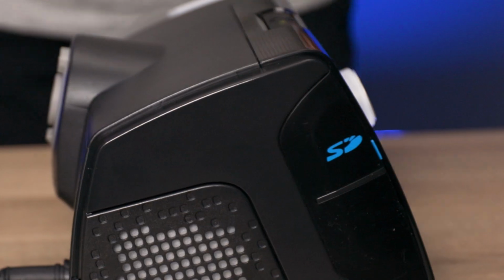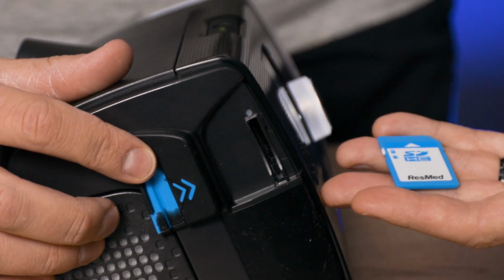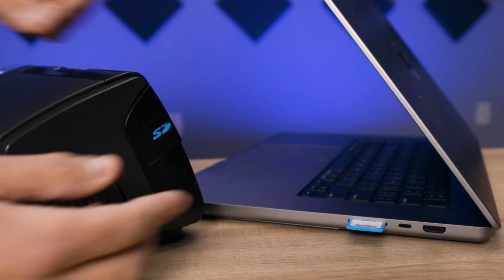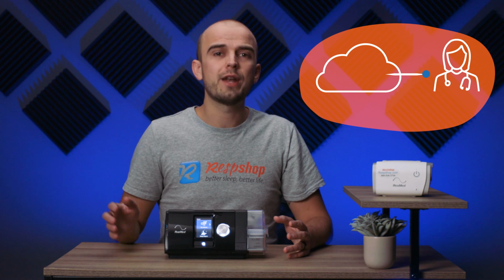This data will also be stored on an SD card that comes with the machine and can be easily removed, allowing you to put the card into a computer to view the data on the monitor or upload it to the cloud. Card to cloud, get it? Once on the cloud, you can share the data with your doctor, those that need access for compliance reasons, or anyone else that you would like to grant access to. And of course, you can also give the SD card directly to your doctor so they have the details of your therapy and can evaluate your progress the old-fashioned way.